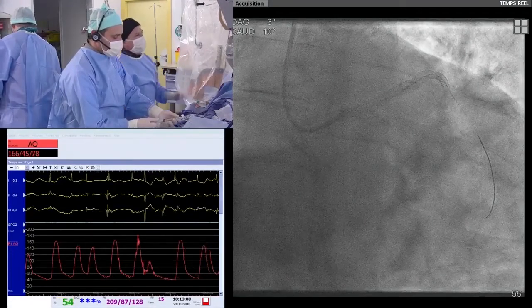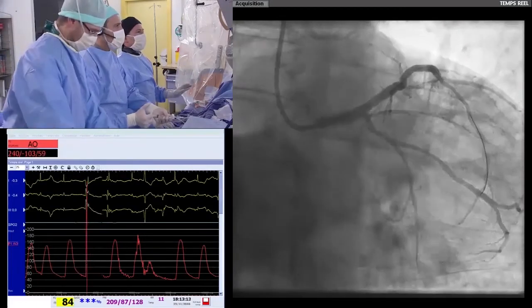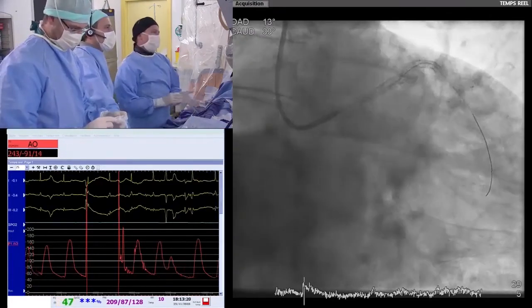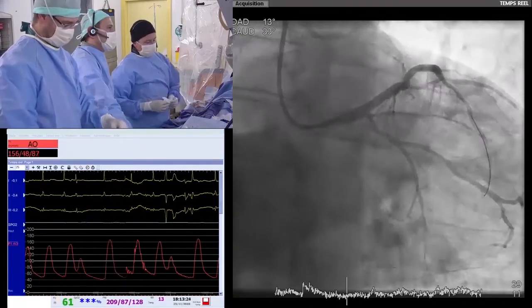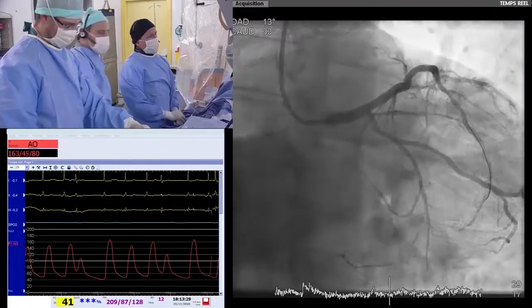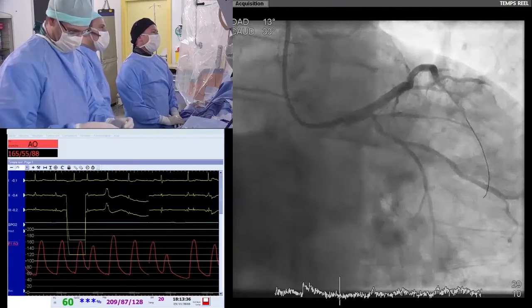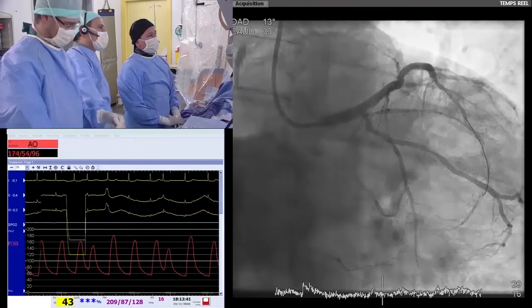Ready? As you know, I am engaged inside the stent. Yep. So actually, it's not bad, the ostium of the circ. Yes, it's not so bad. Exactly, untouched. So usually we open the large branch because in the future we can have to treat the circumflex and the marginal. So you do it by default, actually. Yes, okay. But you know this patient is 80, so we can also accept this result and just follow.